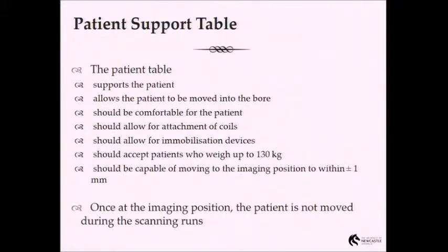They're just too big. So there's been a move towards making larger systems, up to 70 centimetres, because that can be the rate determining step sometimes. It's just the fact that you physically cannot get them in the bore. So the table limit can come into play sometimes. For instance, we have a table limit on the scanner up at HMRI, I think it's 250 kgs. You would not get someone that weighs 250 kilograms in that magnet. They just would not fit.